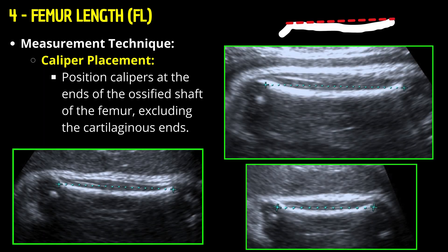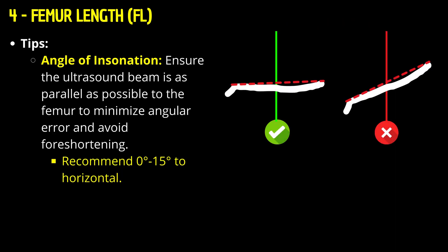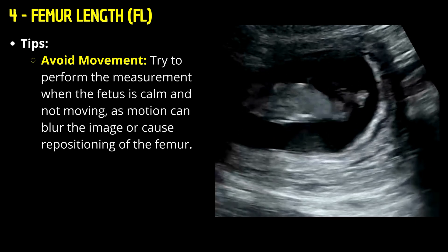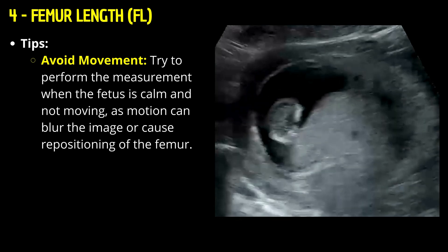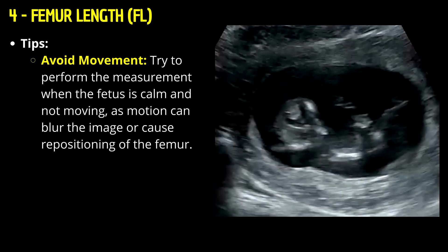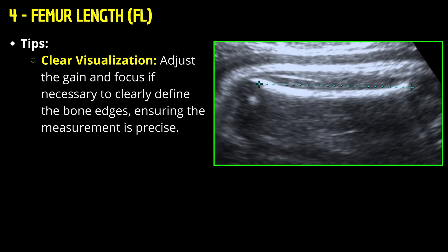Measurement technique for FL: Position calipers at the ends of the ossified shaft of the femur, excluding the cartilaginous ends. Ensure the ultrasound beam is as parallel as possible to the femur to minimize angular error and avoid foreshortening. Try to perform the measurement when the fetus is calm and not moving, as motion can blur the image or cause repositioning of the femur. Adjust the gain and focus if necessary to clearly define the bone edges, ensuring the measurement is precise.